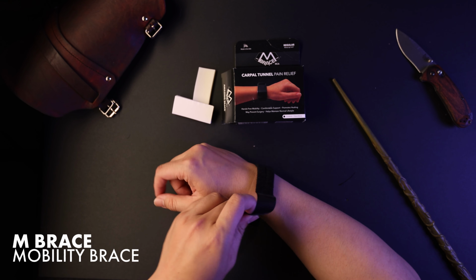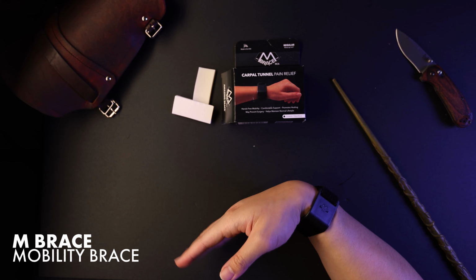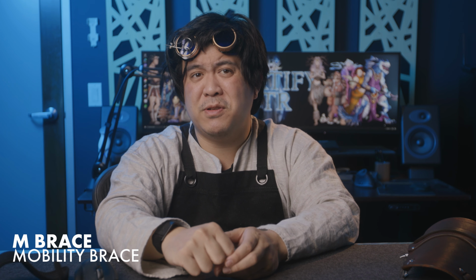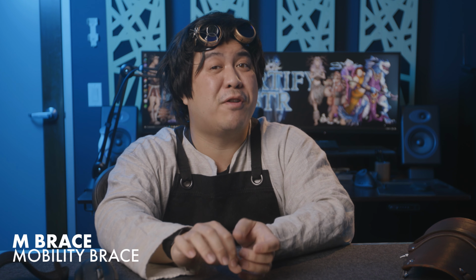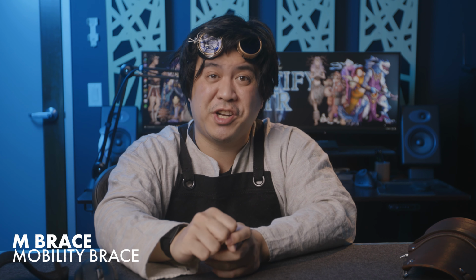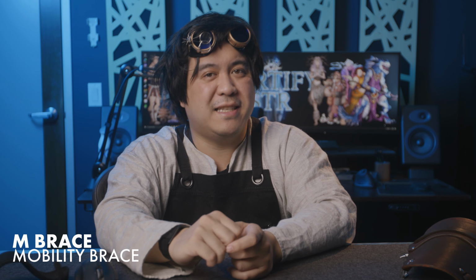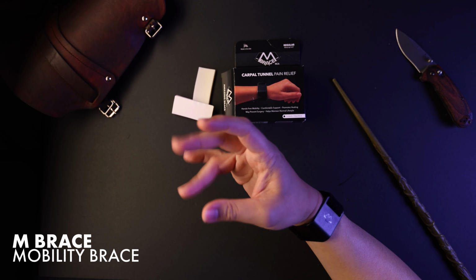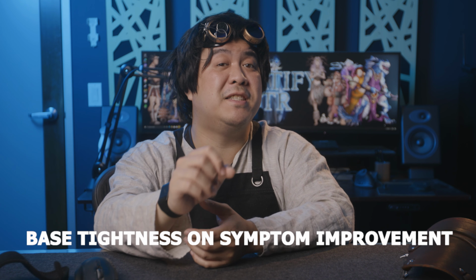Next is an interesting product called the M-Brace, which is basically a bracelet. You place this plastic bracket on the thumb side, you make a fist, and then you tighten the bracelet. Now, this theoretically works like something called a counter-force brace, which supposedly compresses one area to prevent pulling on another area. Now, if you know the definition of carpal tunnel syndrome, you know that it's caused by compression. So when you say, I need to compress an area to make it feel better, I'm a little bit hesitant, but for some people it does work. If you really need full mobility and your symptoms aren't that severe, I'd definitely check this out as an option. Strangely enough, it does add some resistance against flexion and extension if you wrap it tight enough, but too tight may also work you up, so just base it on symptom improvement.